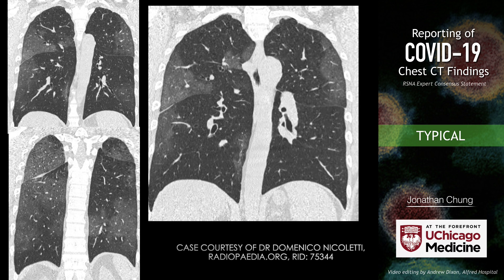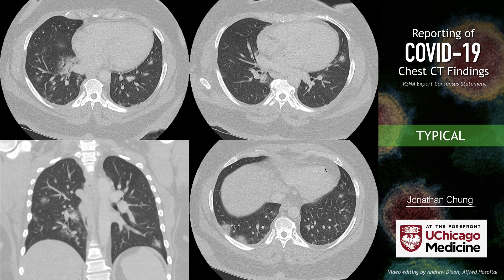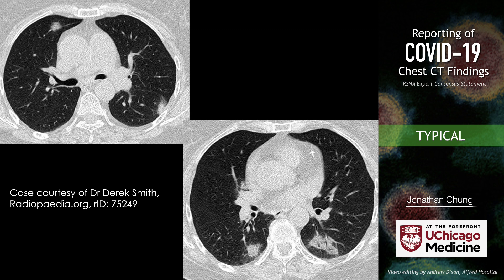Here's an example of rounded opacities within the lungs, shown bilaterally within the lung parenchyma. Many of these areas have ground glass opacity, but there is superimposed consolidation as well. This would be a typical imaging appearance for COVID-19. Another example from Radiopaedia — we have these rounded pulmonary opacities, more consolidation than ground glass, but there is some ground glass superimposed. You can see through some of the more consolidated areas. The consensus statement leaves a little room for interpretation, but I would still say this is a typical imaging appearance.